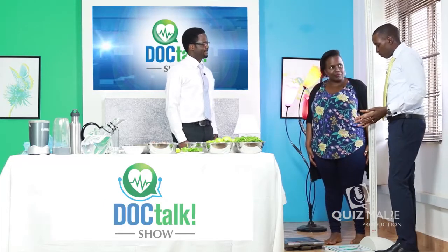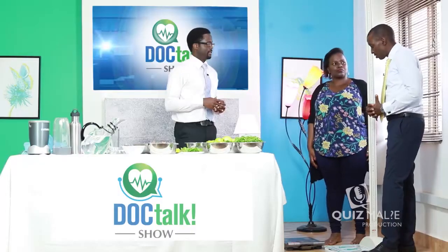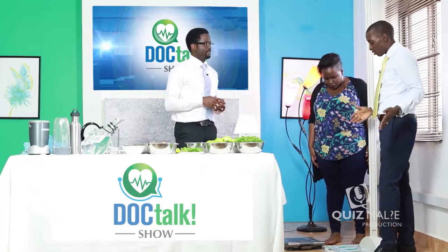So to get started, we first want to know where she is right now, her baseline numbers. We are going to use our body composition scale to know her weight, her body fat percentage, and all these other metrics that are important to measure along the journey. So we're going to ask her to first get on the height scale and we measure her height. All right. Yes, this is 1.58 meters. Okay, so we've established 1.58 meters?